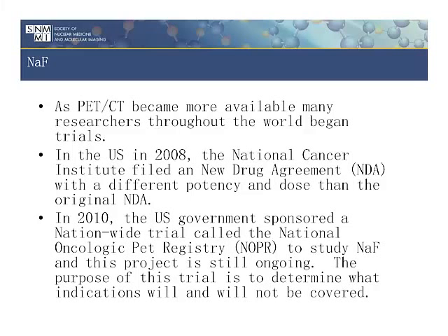What they ask us to do is we have to fill out a questionnaire, the doctor does ahead of time, with what they suspect. The reading doctor has to fill out a questionnaire on the day of the exam based on his or her reading findings. And then the ordering physician has to fill out another form saying how the sodium fluoride changed their management. This is how the U.S. government is moving towards new tracers. I think it's a pretty good system.